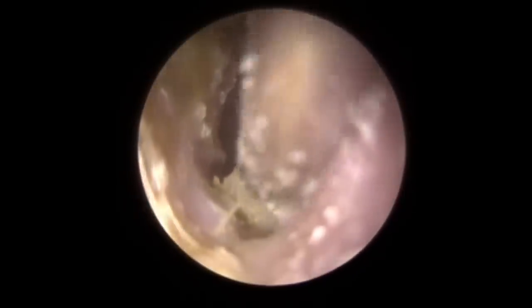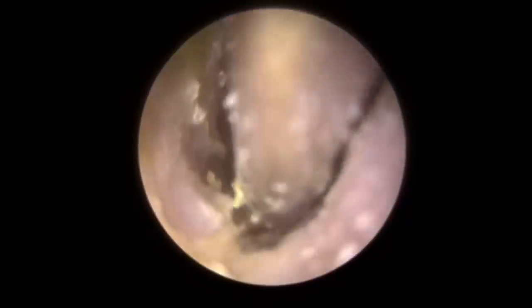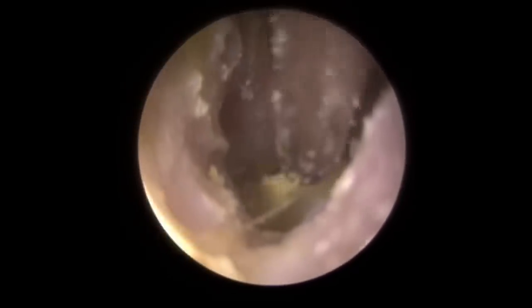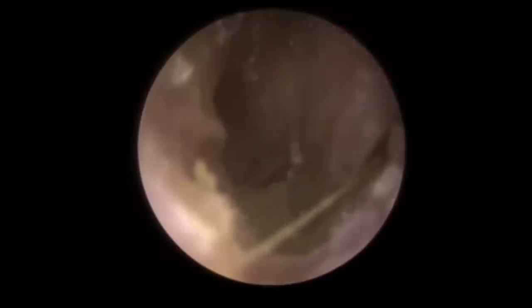Now I can see there's a bottom section in this valley — there's this lighter material with a fuzzy top to it, which is a bit of fungal infection. There's an annoying bit of skin getting in the way so I'm going to get rid of that. Watch what happens as we lift it — we're getting a pull further into the canal, so we're going to run with this and take this all the way down. That's the edge of what's down in the valley and covering the bottom of the eardrum. Look how big this is when we start lifting it up — that is a huge piece of fungal infection skin, a really thick layer. We're going to switch to the standard size in here because that fine end is not going to hold on to that tight enough.